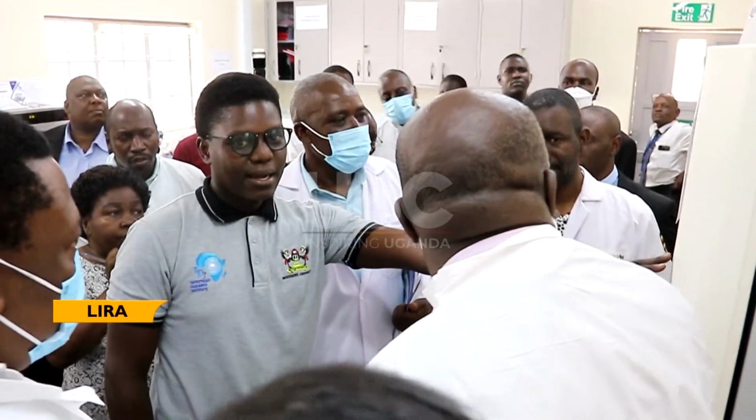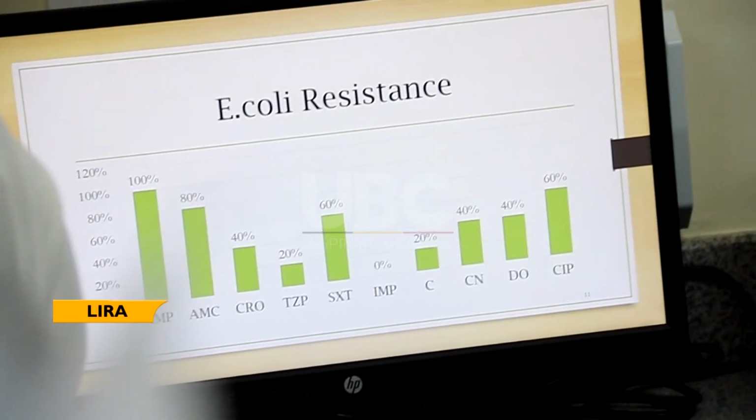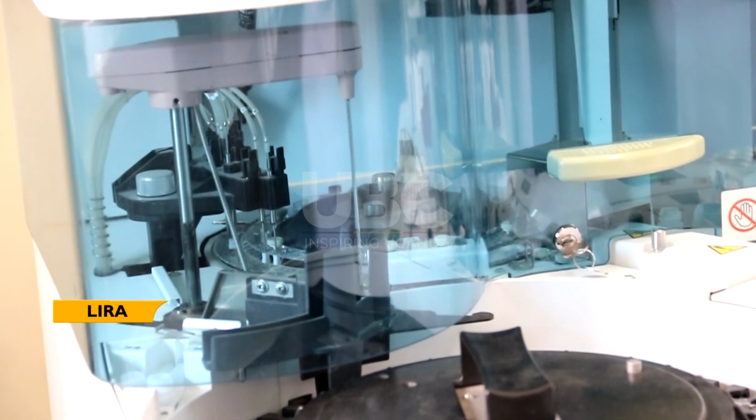The hospital director, Dr Nathan Onyachi, says the new lab has helped the facility to treat more effectively than before. So if a patient comes with urinary tract infection caused by E. coli that we have found in the hospital here, and you give him ampicillin, it will not work. How have we been able to discover that? We have been able to use the new facilities to find that out. So we are now going to be very careful with ampicillin on our patients. Previously, we would just prescribe, and then the patients would keep on swallowing, and then they don't get better and they come back.